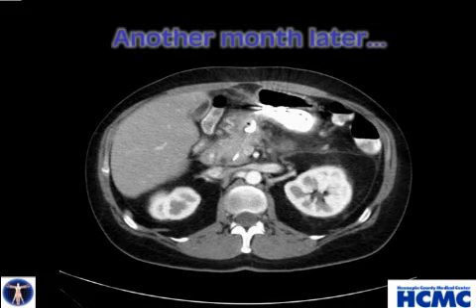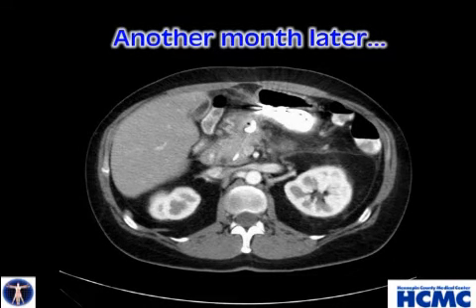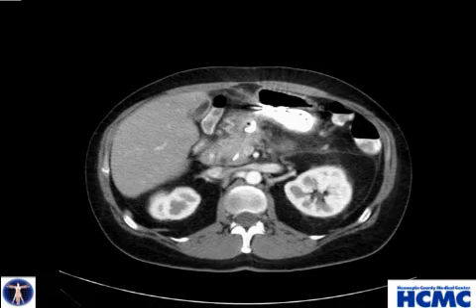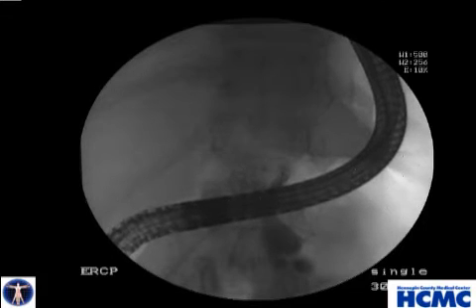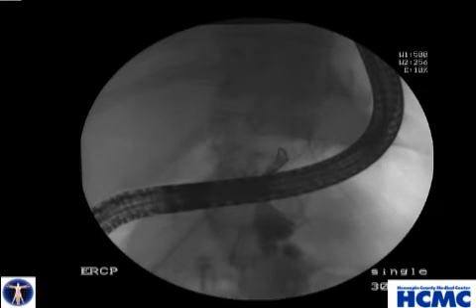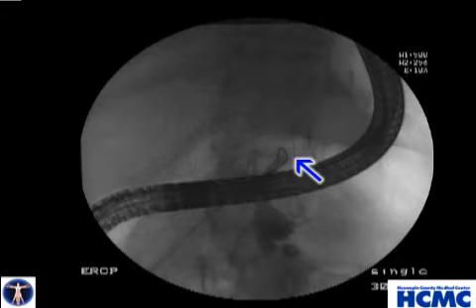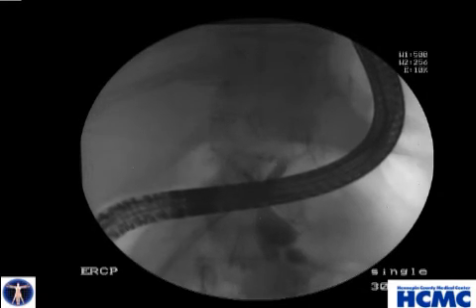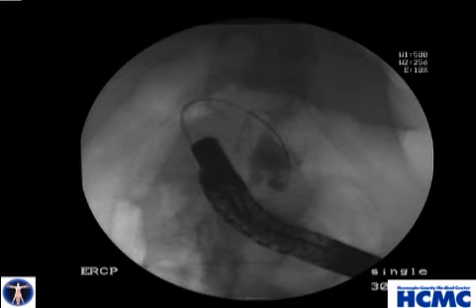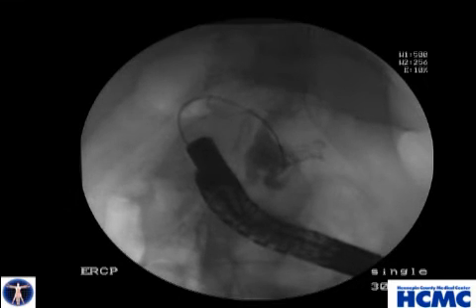1 month later, after full-time employment is resumed, the patient is actually doing very well, and you can see that the cyst cavity has completely resolved. At the final procedure, all stents are removed, and you can see that at pancreatogram, the stump of the pancreatic duct ends and just fills the collapsed cavity where the cyst used to be. Then injecting through the cyst gastrostomy tract, we're again filling that cavity.